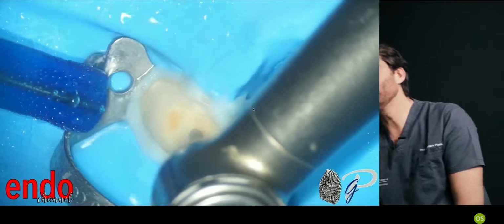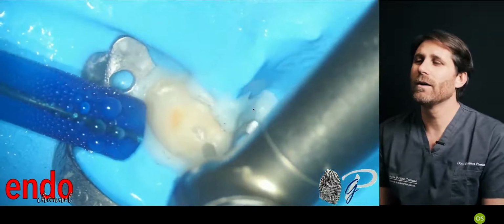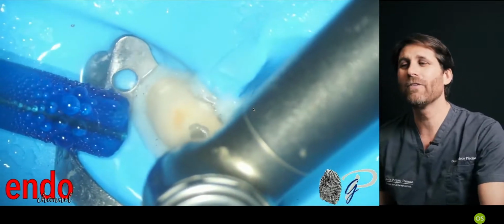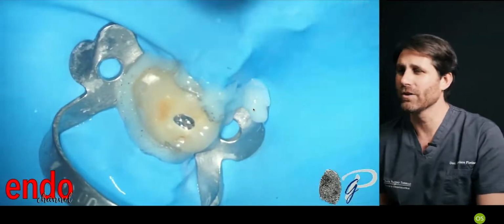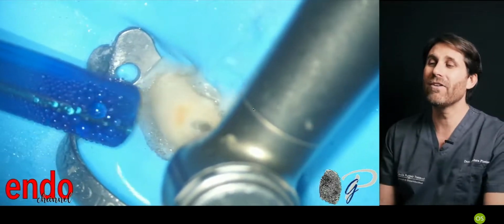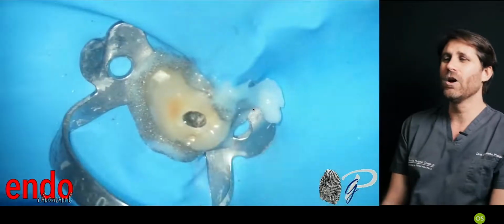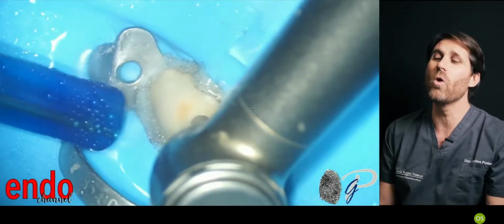I like to use the diamond-coated burr from this kit to remove the ceramic if we have ceramic on the metal or on the zirconium. It is a very effective burr in cutting, long-lasting, and permits us to remove the ceramic with low vibration. Then the multi-blade carbide burrs or cross-cut burrs remove the metal part or the zirconium part very effectively and fast. Look, it is very effective in removing this part of the metal. Obviously, always use new burrs. And then I took again the diamond-coated burr to open the access cavity.